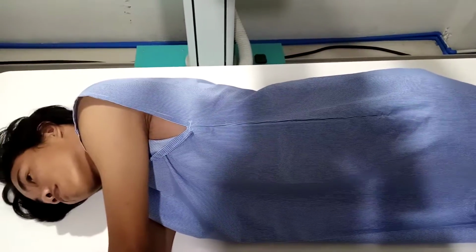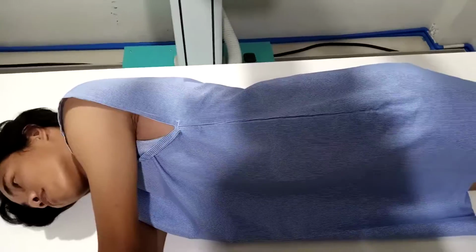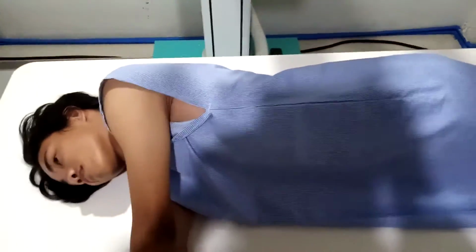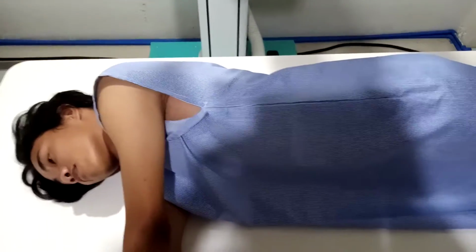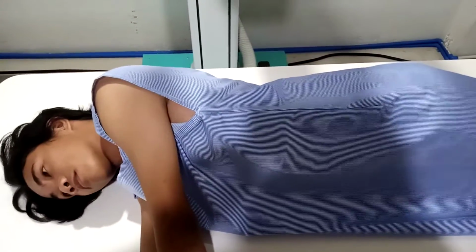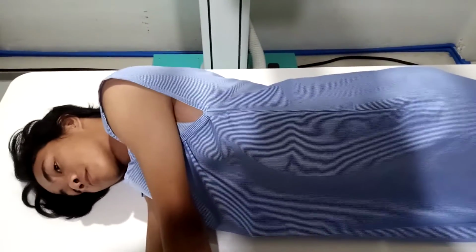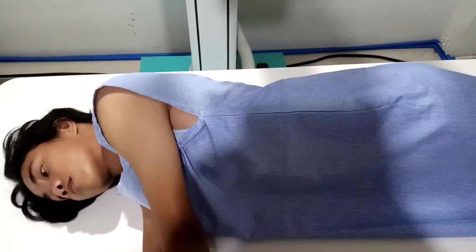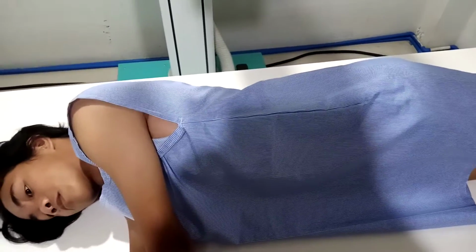We place the top of the IR 1.5 to 2 inches or 3.8 to 5 centimeters above, and make sure that the patient's shoulders are relaxed. Elevate the head and spine level, extend the arms. So we need to elevate the patient's head for comfort.